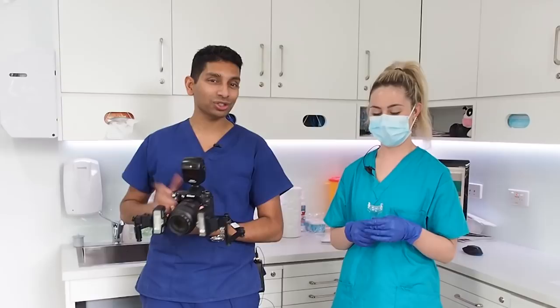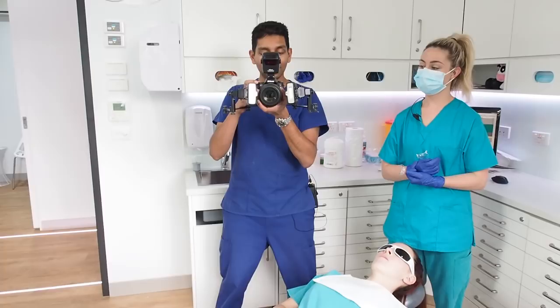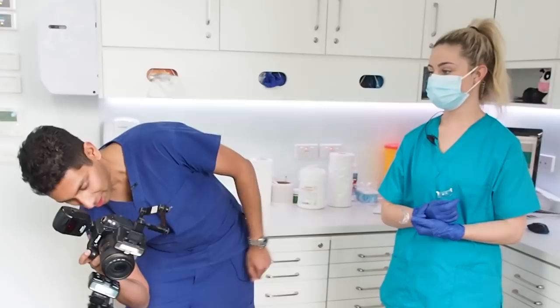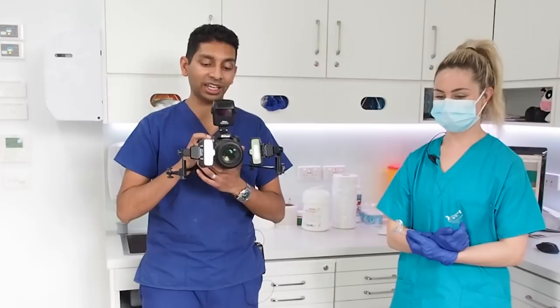When you're using a camera, most of the time we've seen them on a tripod — and with a tripod there are three legs. Usually you have your feet apart and your hand on the camera. The trouble is that when we do dental photography we need to hold a mirror as well, so you don't have that third leg of your tripod. A few ways to address that: one is to put your elbow on your knee, or you can lean on your nurse — put your elbow on their shoulder just to give yourself that extra support. Otherwise your camera is shaking and it can't get the autofocus.